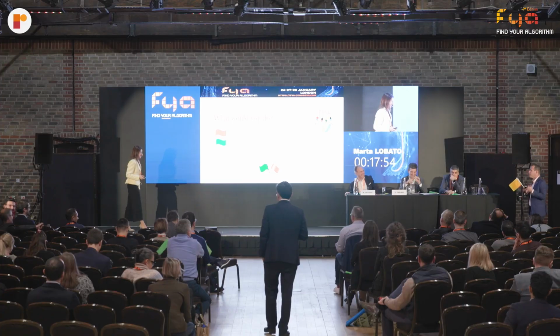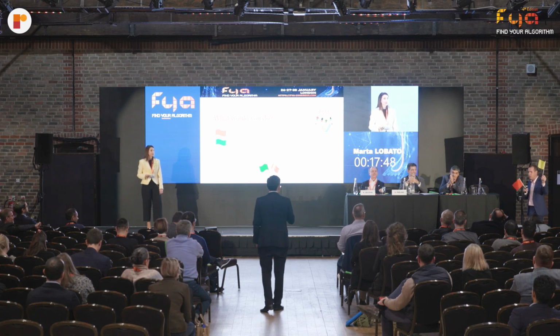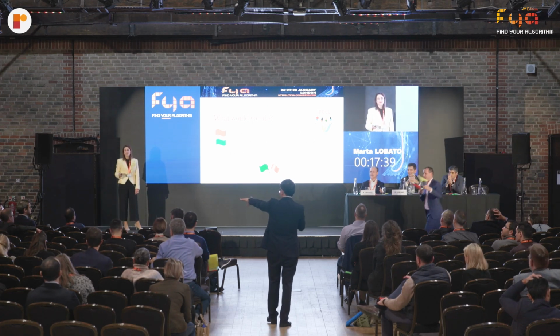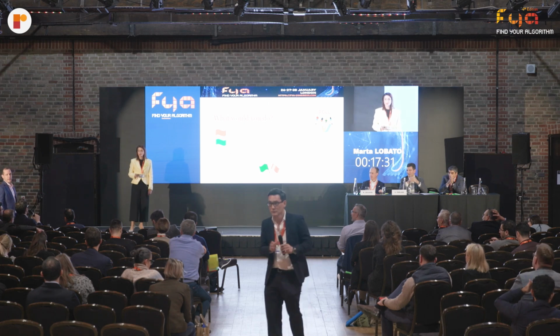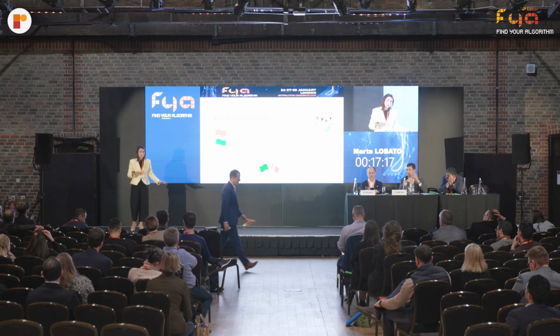I personally would check the GSV. No one would do it, I'm the only one in the room. Usually I'm the more endovascular guy. I mean, you could see, maybe this could have been enough. And then probably if you just go straightforward, no difficulties in the FEMPOP, you can go on, and otherwise you can just see what happens. Okay, could be, but it's a really huge lesion at the level of the foot, so maybe we'll need more.